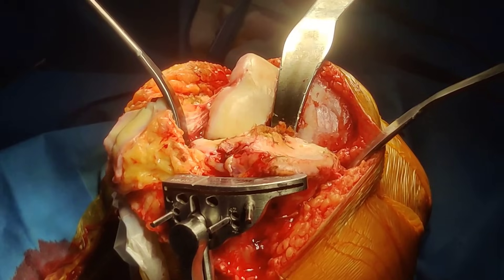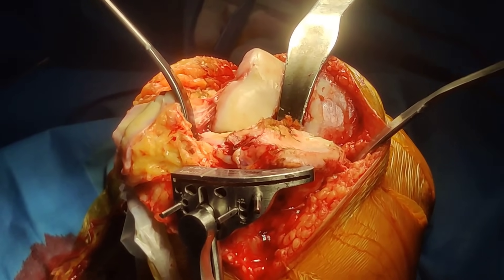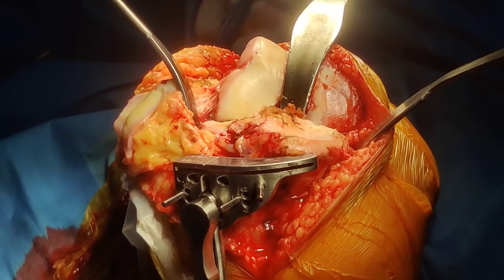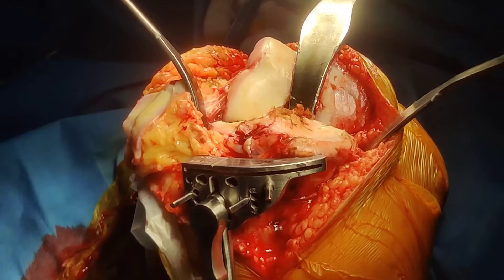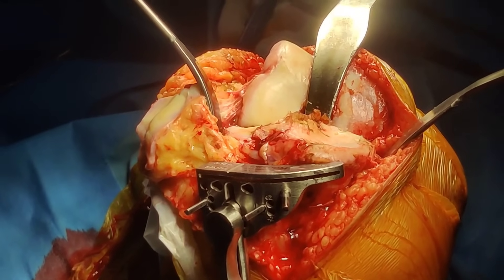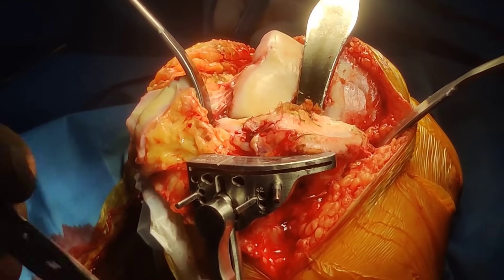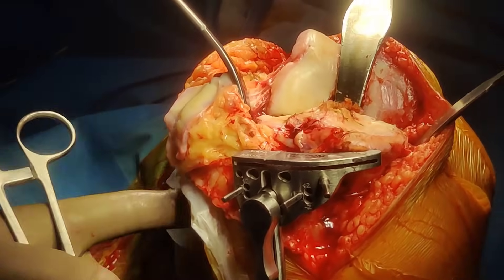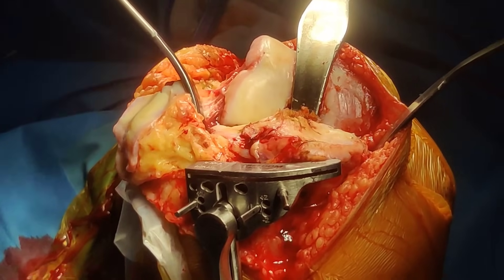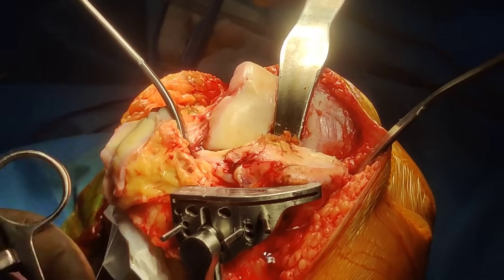Knee replacement involves a lot of cutting bones, and if you want to cut bones you need to cut them properly to get a good desired result. The first and foremost things to do before any cut — I'm not going to go into how much to take as I've already uploaded a video for that — but you need three retractors. One is protecting the medial collateral ligament.